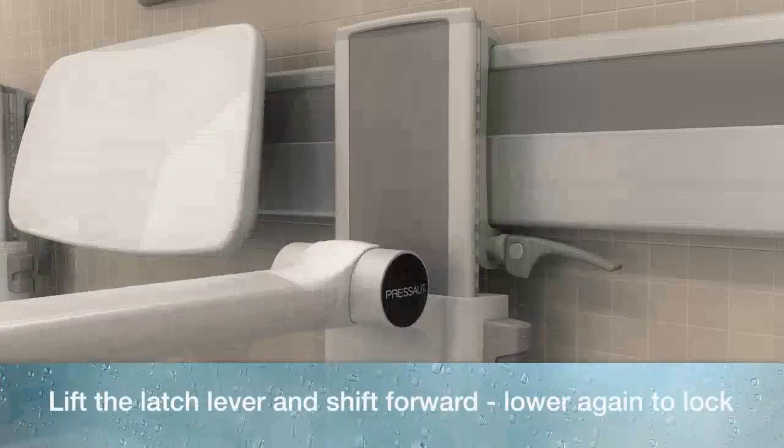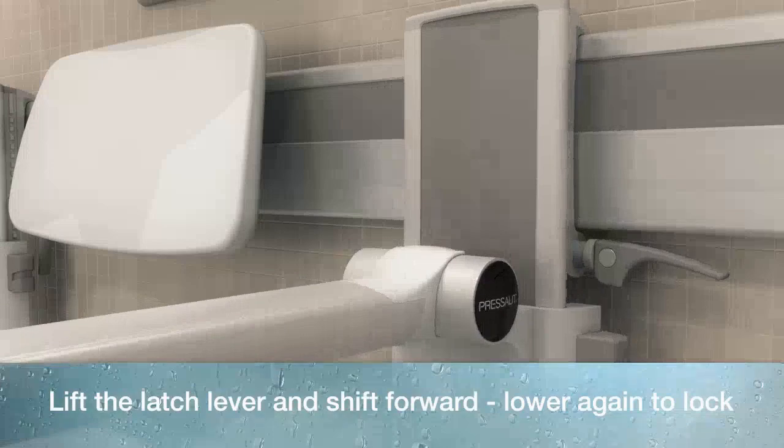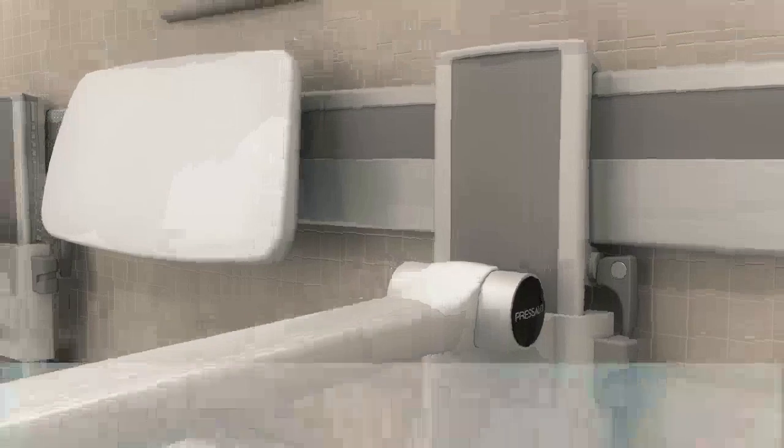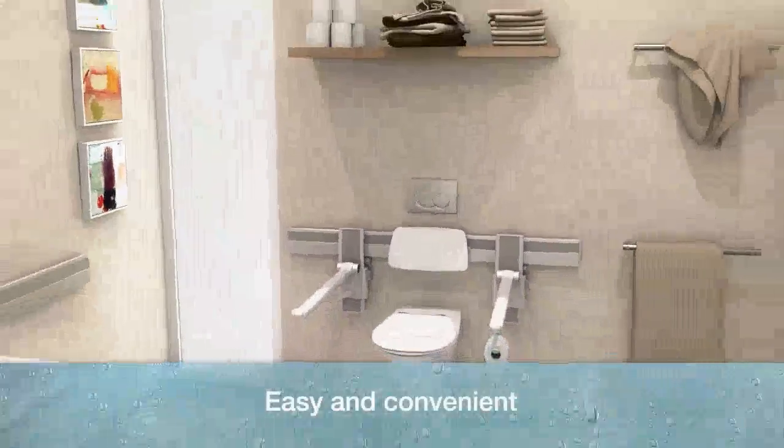Lift the lever lock and move the support arm to the desired position on the horizontal track. Then lower the lever lock to lock it into the new position. Easy and convenient.